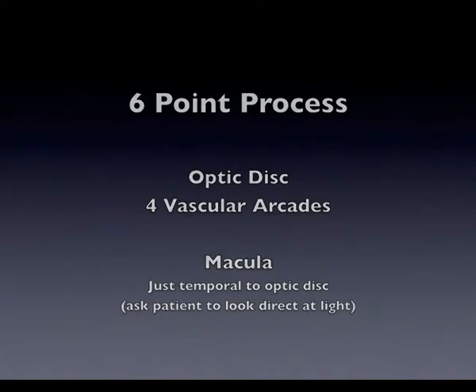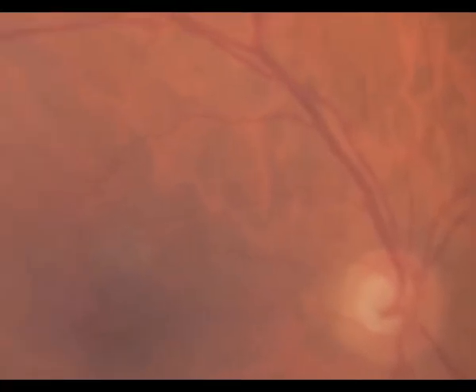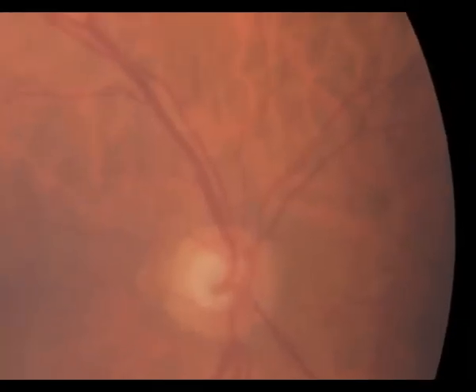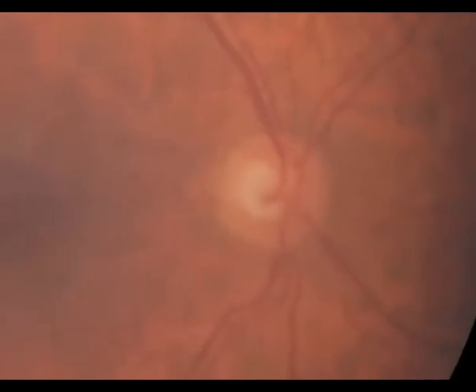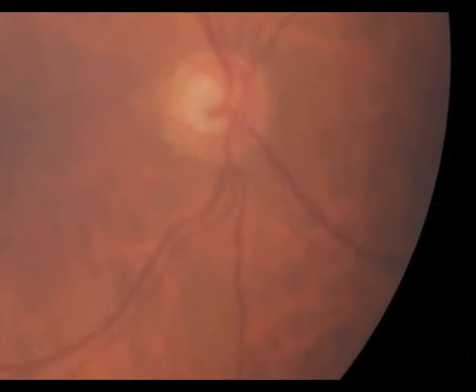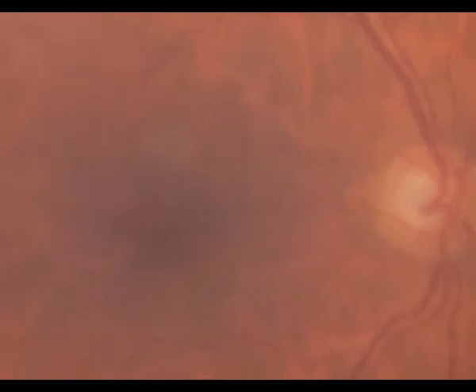minimize patient discomfort. So once again, the examination starts at the optic disc before moving on to the supratemporal arcade, supranasal arcade, inferotemporal arcade, infranasal arcade, and finally looking at the macula.